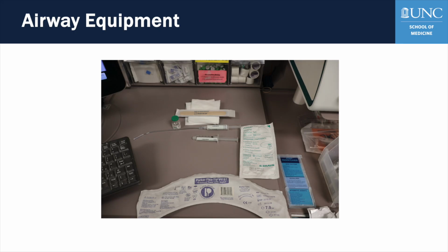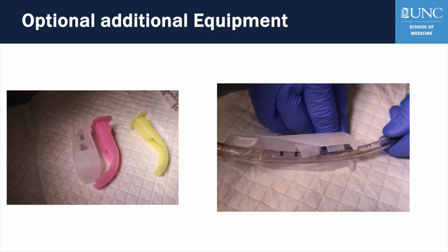Before bringing the patient to the room, ensure that all equipment is present and functioning. Have an atomizer ready with 10 milliliters of 2% lidocaine drawn up, with additional basic equipment such as nasal cannula, mask, nasopharyngeal airways, gauze, and tongue blade. Ovassapian airways are optional equipment that some may find helpful as well.